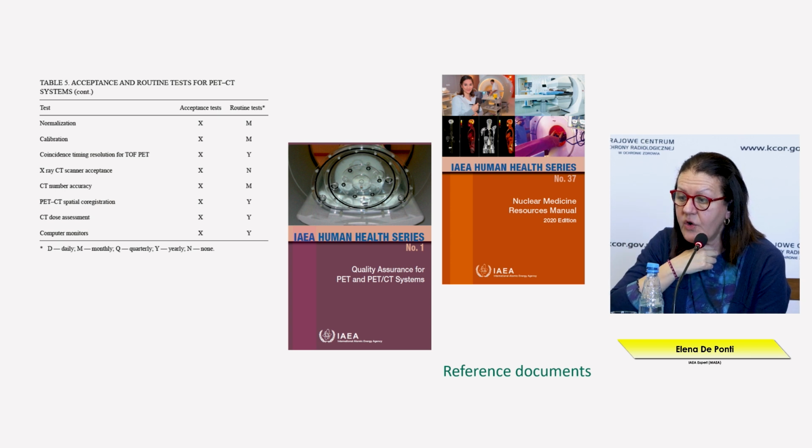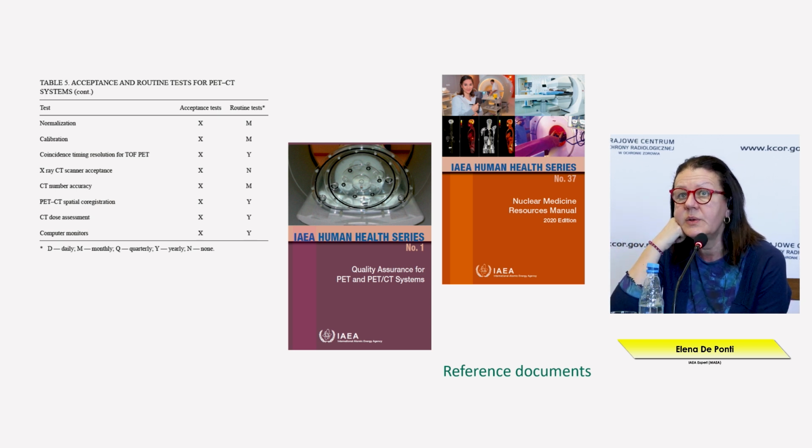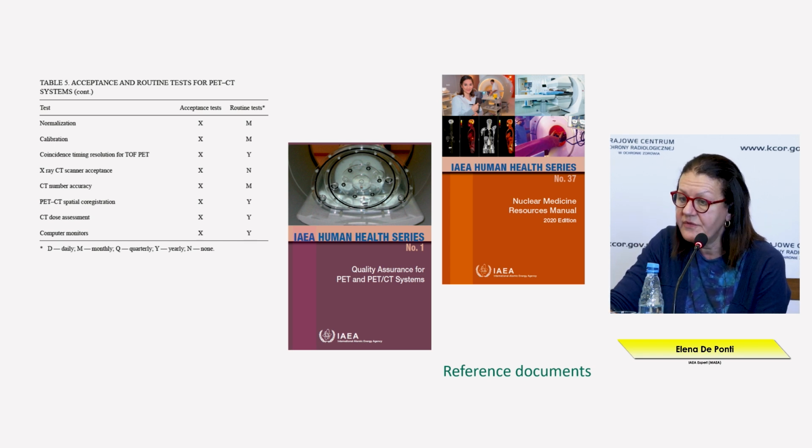We have some documents that we can use as a reference for setting our own quality control protocol, and we have a list of tests that should be done, and also a suggested frequency that could be daily, weekly, monthly, and so on.